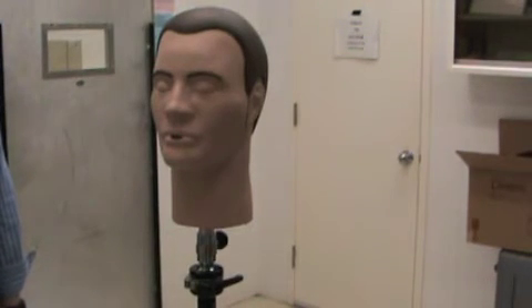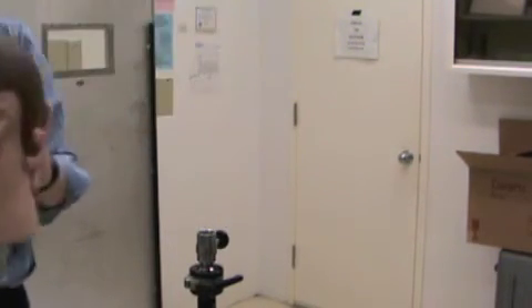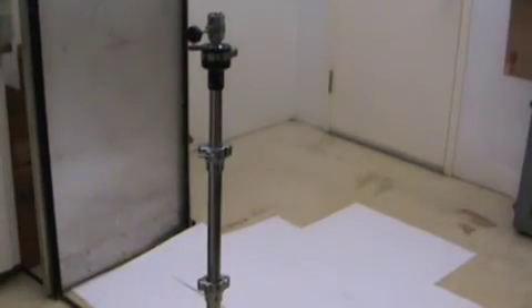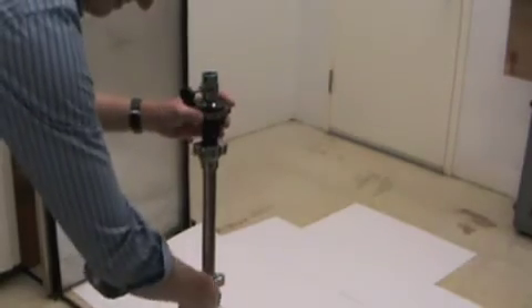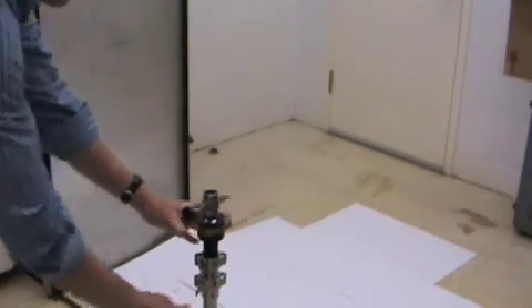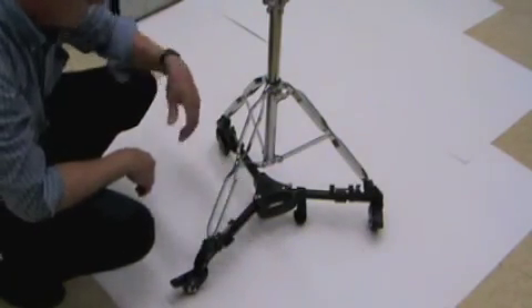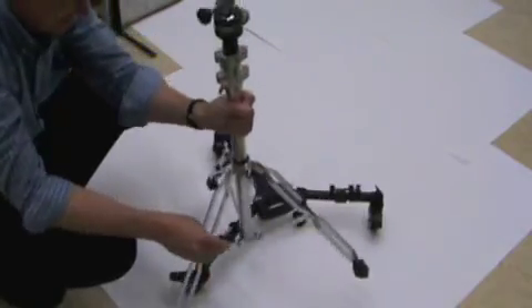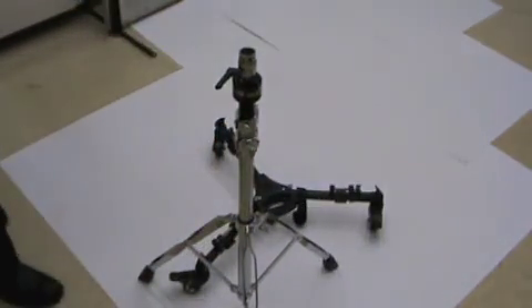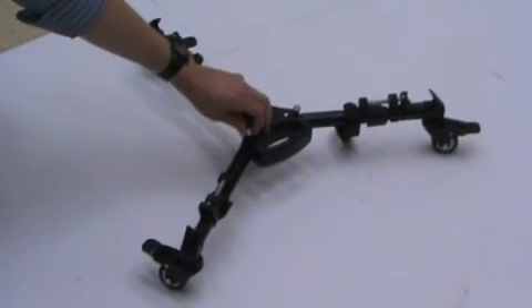To disassemble your Dexter, loosen the knob in the back and remove his head first. Now you are ready to take down your stand. Loosen the top wing nuts and collapse the stand. Unscrew all three tripod foot clamps and remove the tripod from the dolly. To collapse your dolly, pull the release pins and fold the legs.